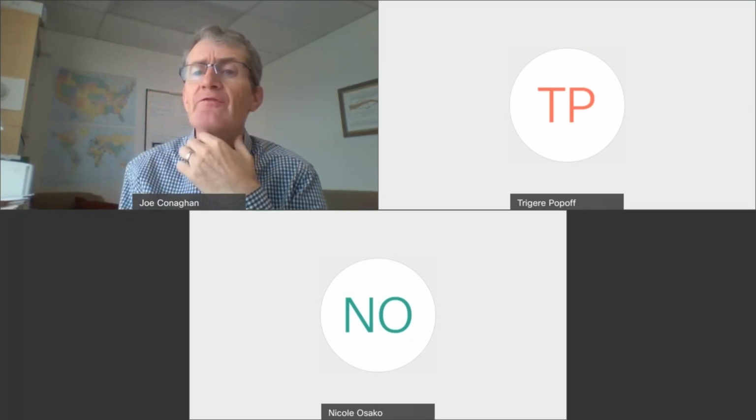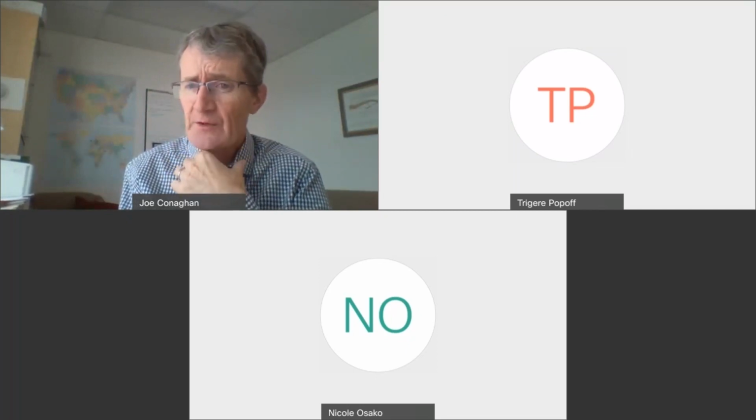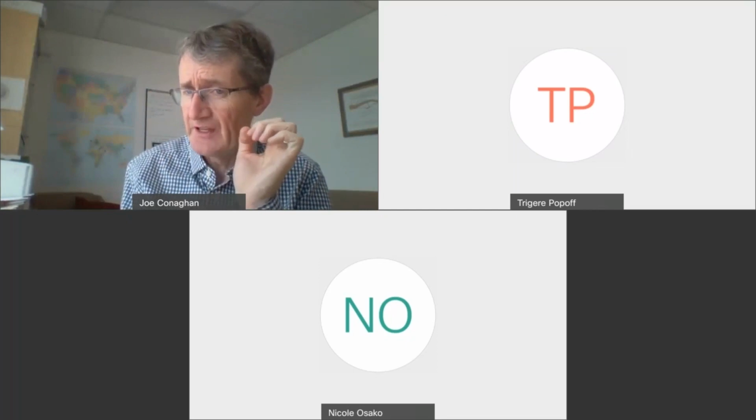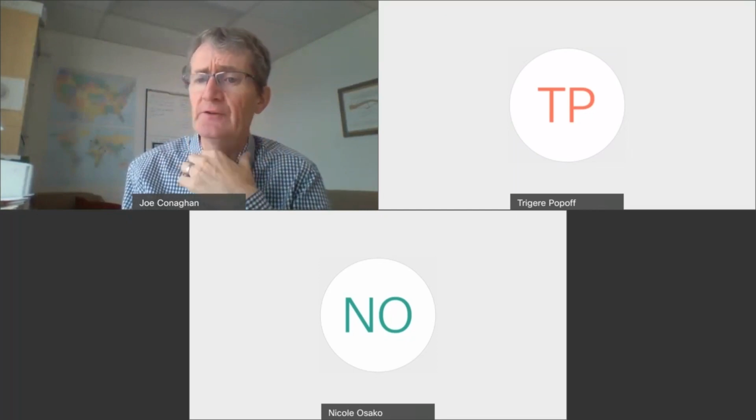So the answer we were looking for right here was 2 to 3%. You shouldn't have a no-call rate of 0. Less than 1%, not sure about that either. I think somewhere in the region of 2 to 3% is the sweet spot, because then you're not taking too many cells or too few cells.